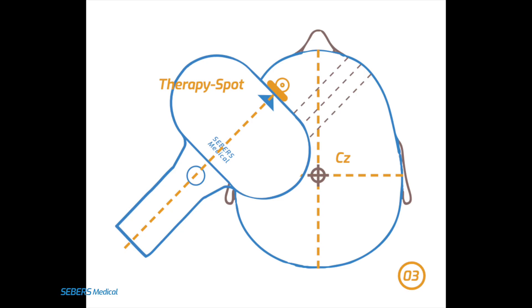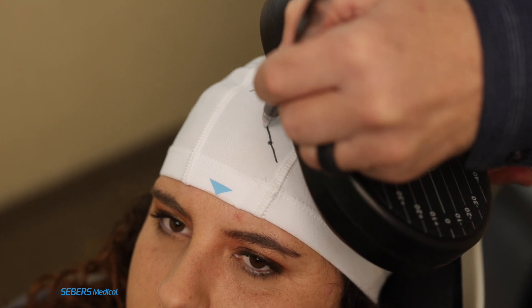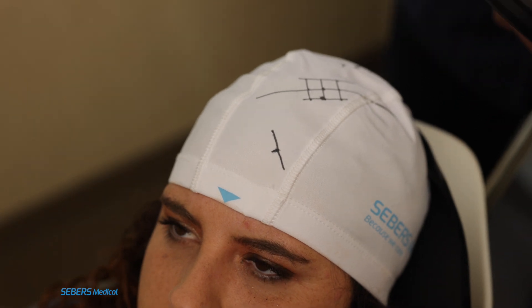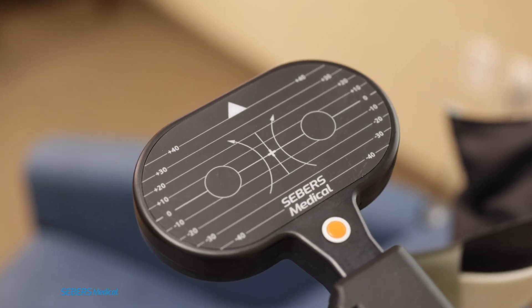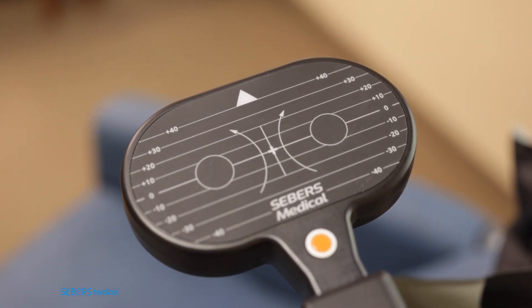The final step is to align the coil at a 45-degree angle over the therapy spot. Once the coil is in position, mark both the therapy spot and the edge of the coil to lock in the correct angle. Remember, the pulse comes from the center of the coil, but since we can't see that, we rely on the coil's edge for consistent positioning. By marking the edge, we ensure the same angle and placement can be repeated for each treatment session.